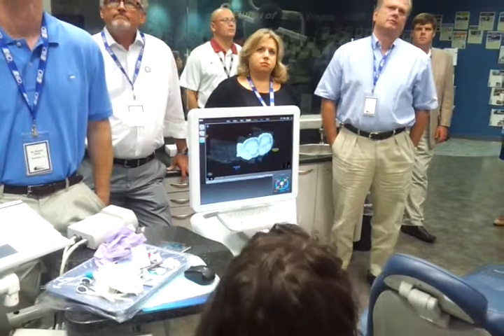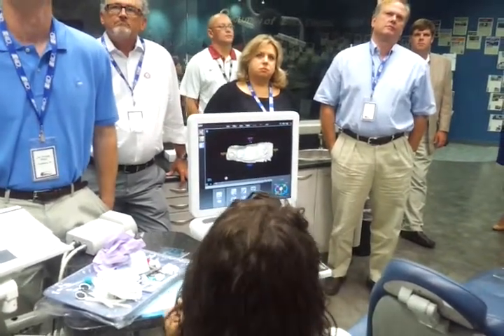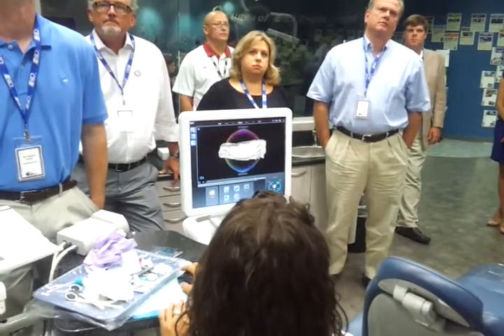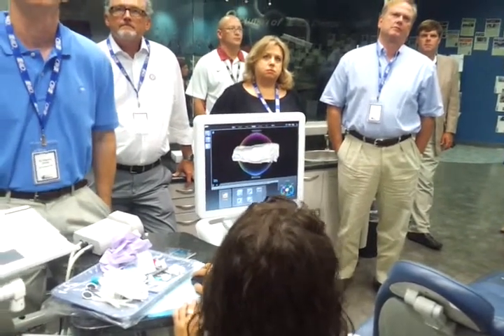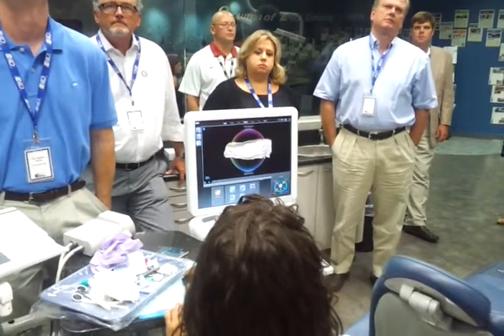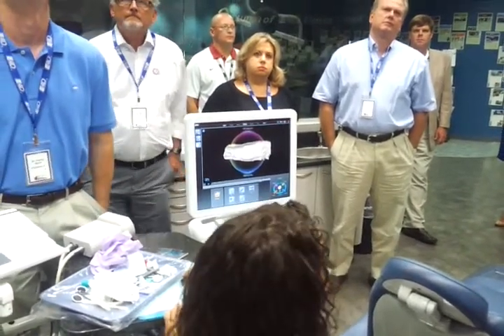Now once we get into the margin, what I'm going to do is set an orientation. An orientation for each tooth. Well, what's orientation? Orientation is, let's think of it kind of like path of insertion, okay? How is this tooth going to drop down and then form to fit in the occlusal plane, okay?